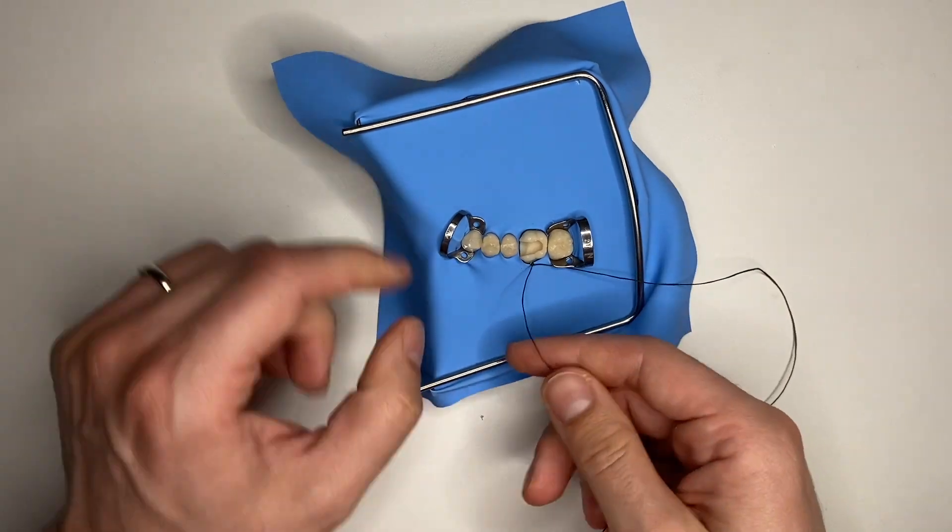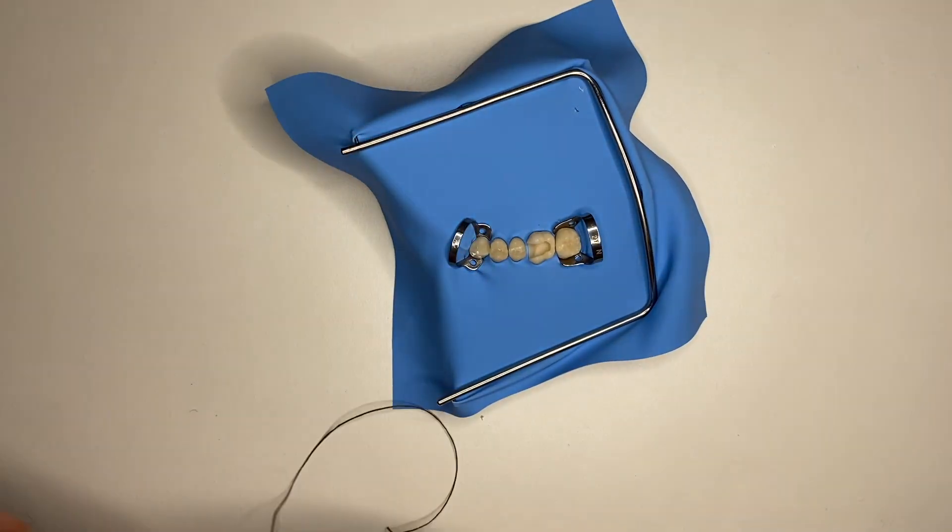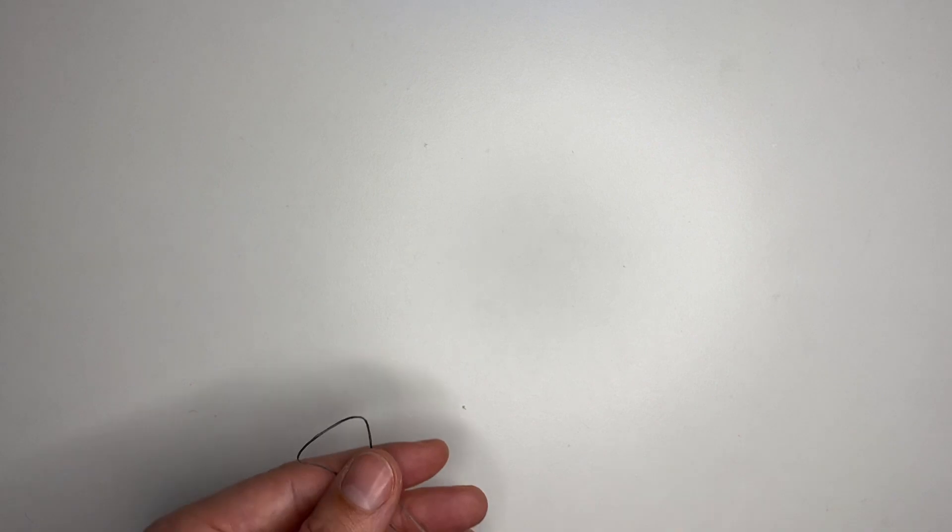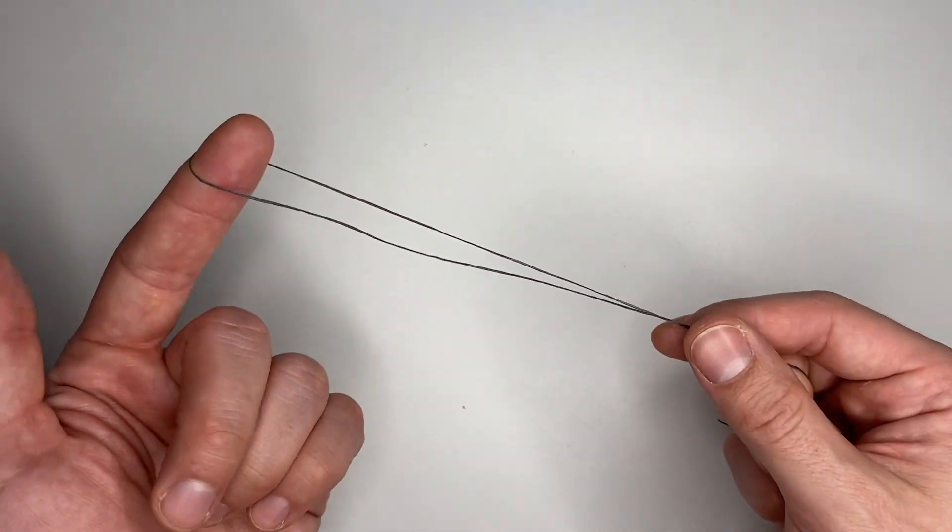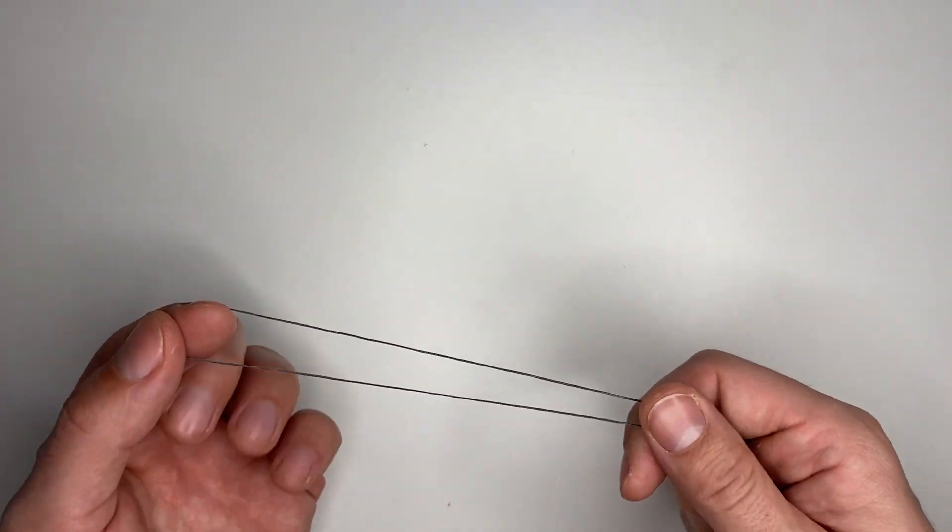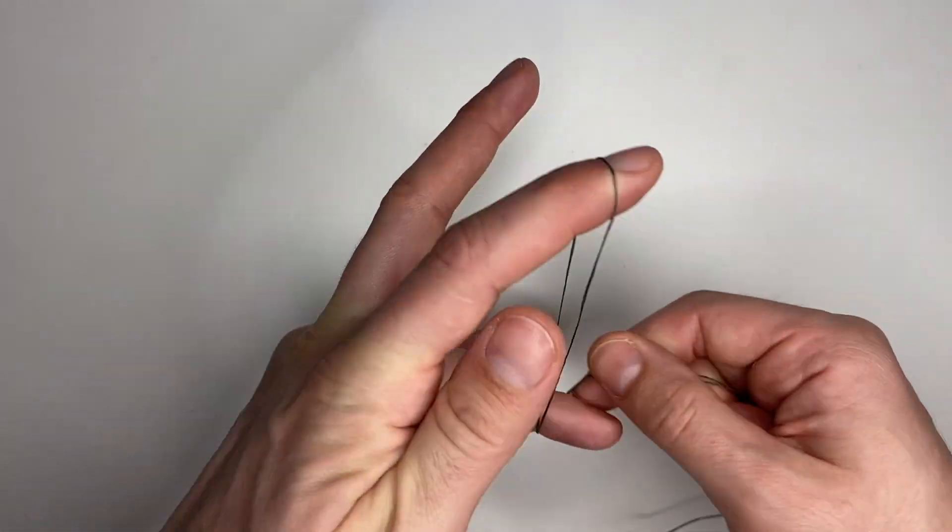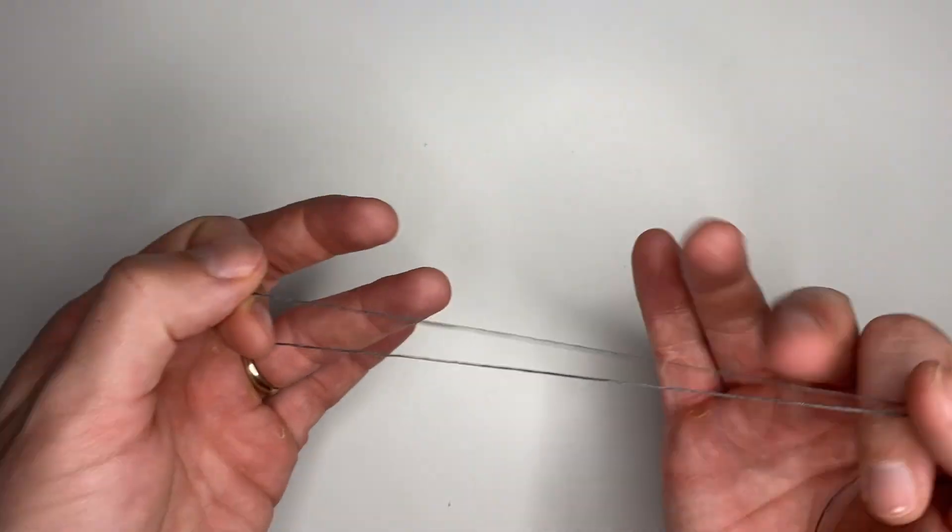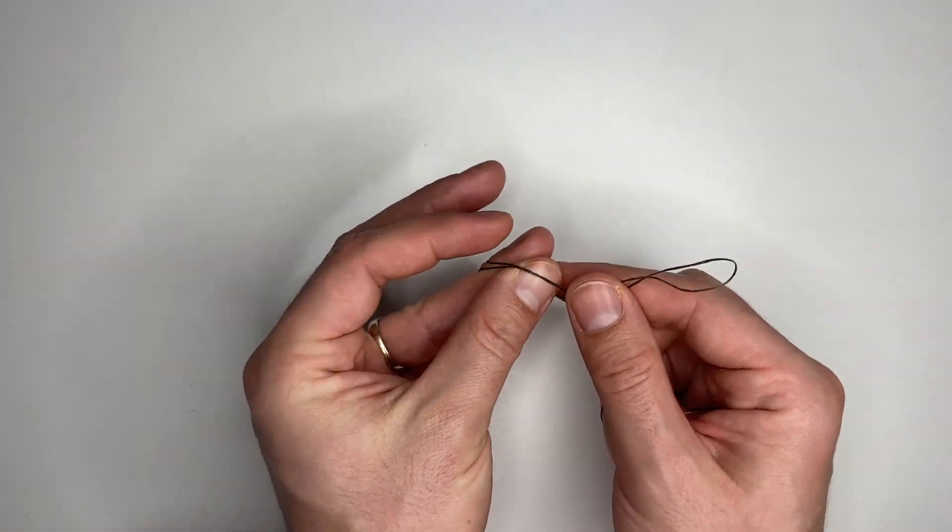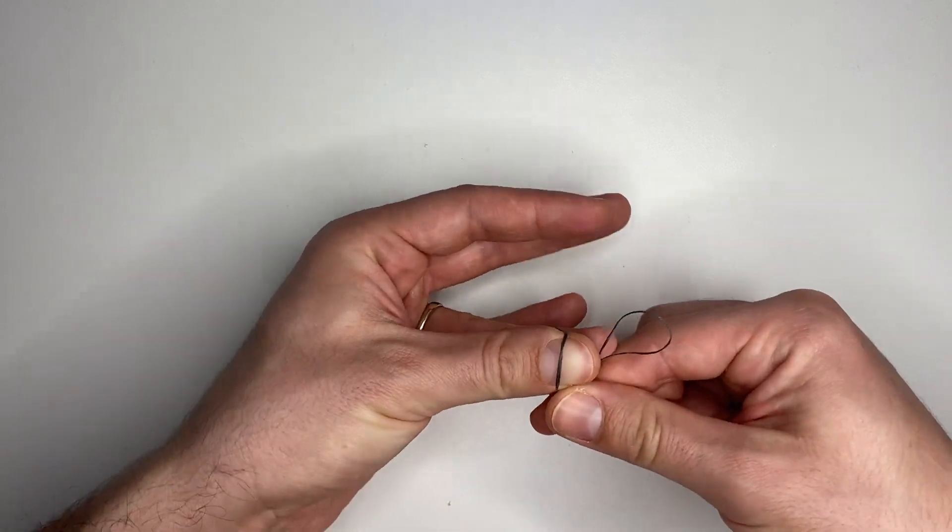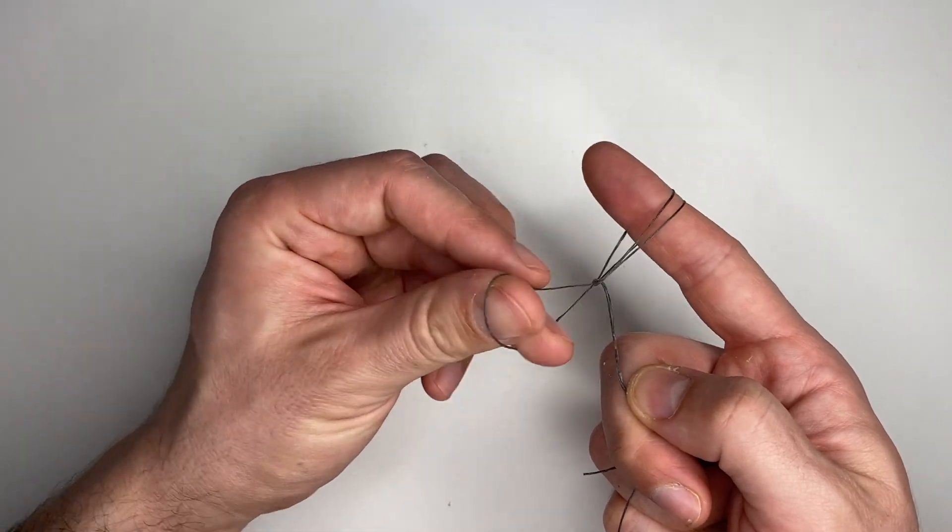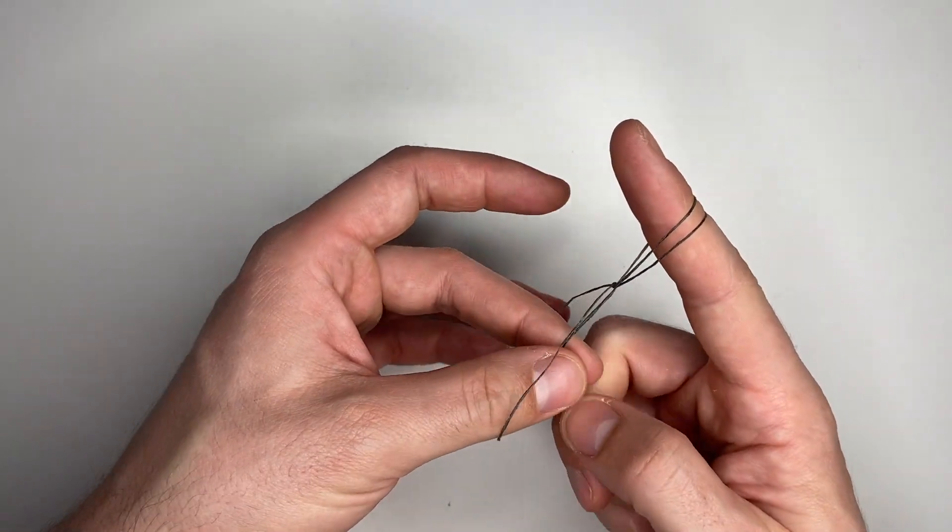However, sometimes this won't work, so you need a different kind of ligature: the self-tightening one. Just like the first time, we're going to fold our floss in two and make a nice bow in the middle. Then we're going to put the end through, but we're not going to let it go. We're going to put the other end of the ligature through right here.